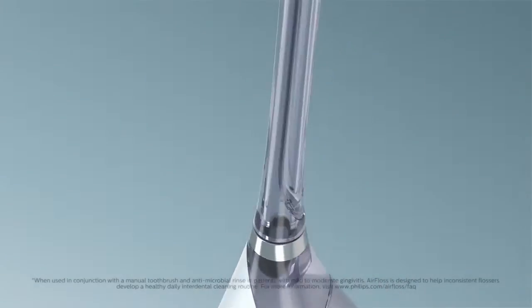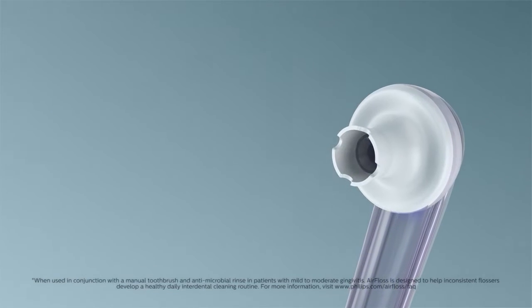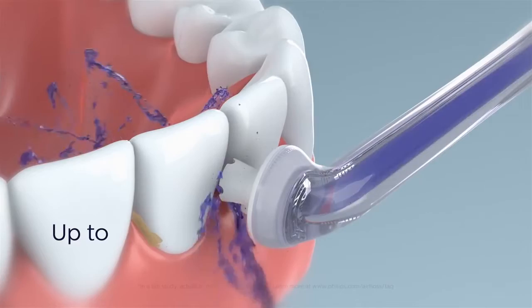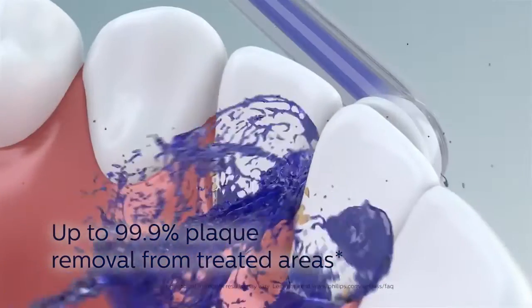The Philips Sonicare Air Floss Ultra is clinically proven as effective as floss for gum health. It uses the unique microburst technology for up to 99.9% plaque removal from treated areas.